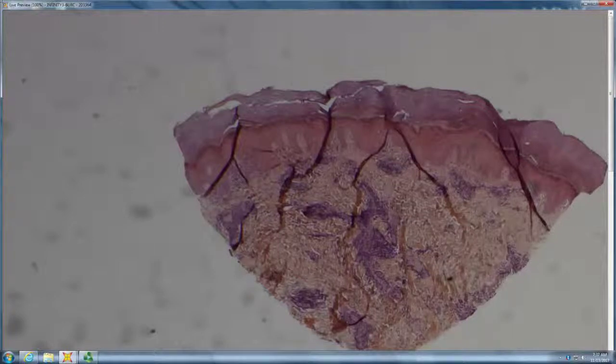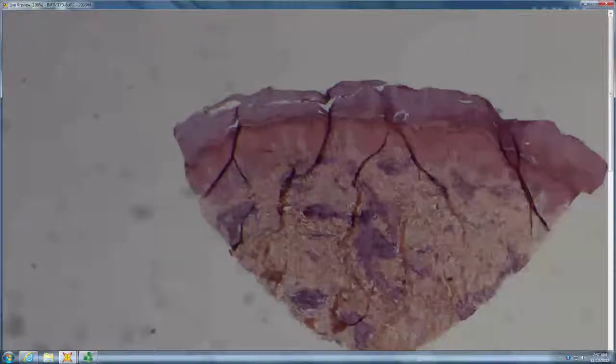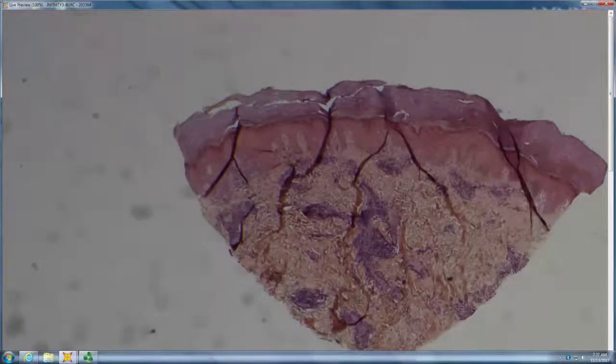It includes stings, bites, burrowing things. So it's just arthropod in general. So this is Wells. In this case, it turned out to be caused by scabies, but all Wells is basically some kind of arthropod reaction, just exaggerated.